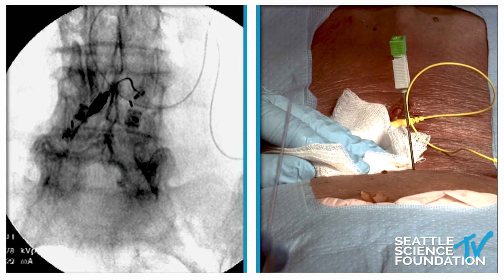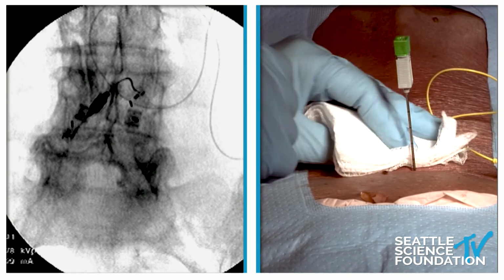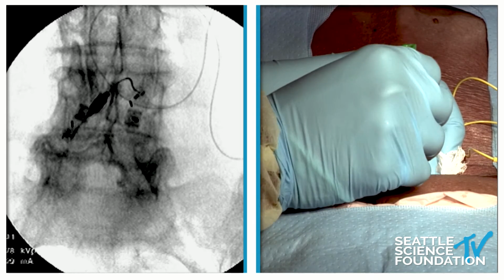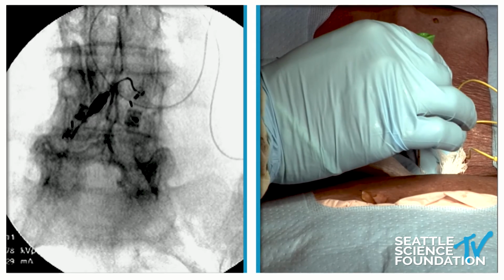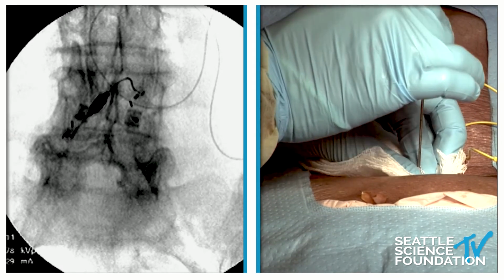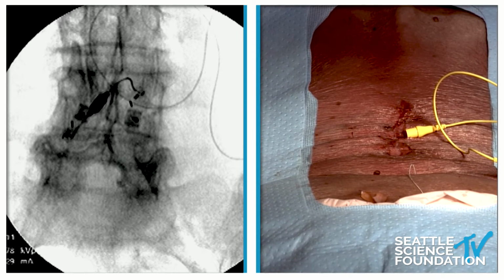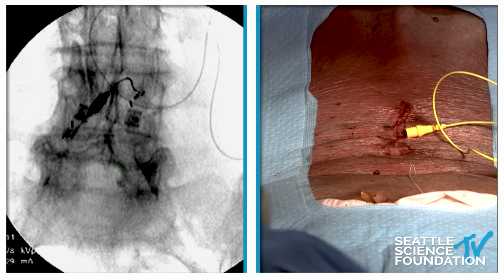So that can happen. Sometimes the lead won't catch onto the tissue as well. So we'll try that again. And on the right side, we'll, again, put down pressure, and I'll rotate. Just hopefully the lead will stay in place here, catching on. There we go. That's better. So that guy looked better. And I'll just load up that other side once again so we can get that lead back in.